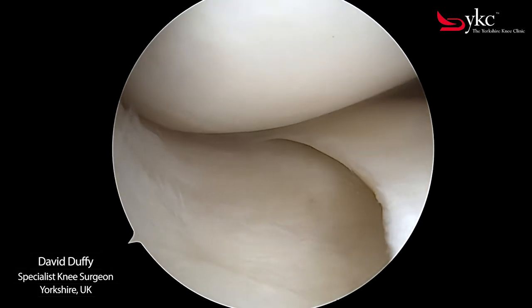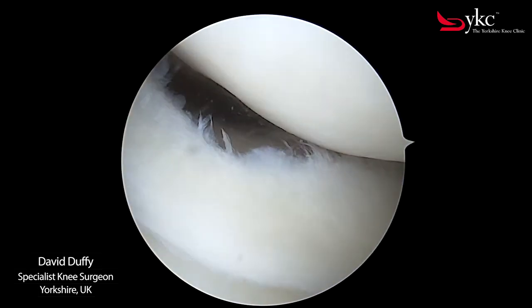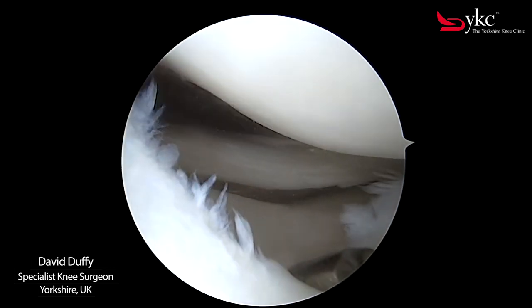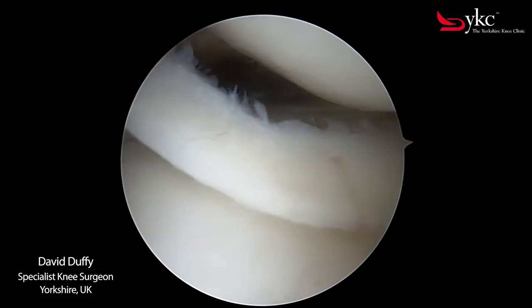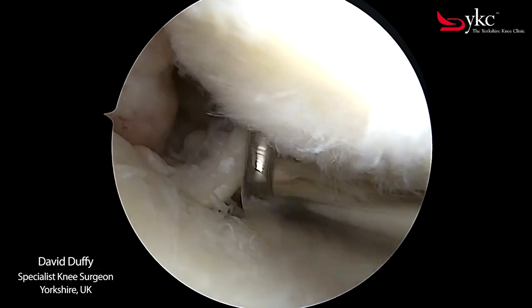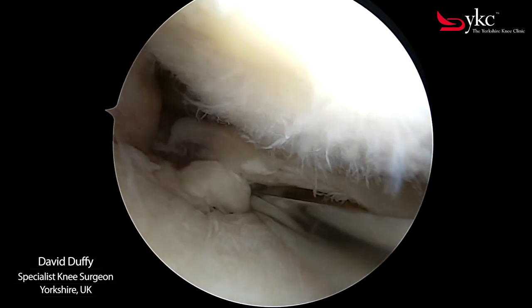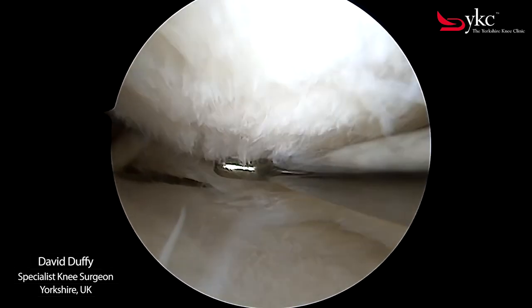Here I am examining normal cartilage within a knee, which has a smooth appearance. Damage to the cartilage or meniscus can occur if the knee has episodes of instability or gives way — here is such an example with a torn displaced meniscus. Long term, repeated episodes of knee instability can lead to wear or arthritis developing at an earlier age. Here the articular cartilage is becoming worn and has lost its smooth appearance.